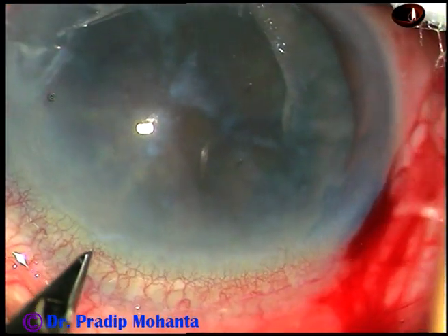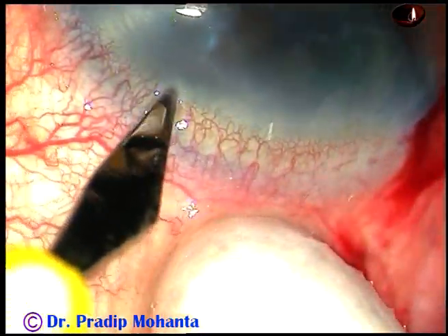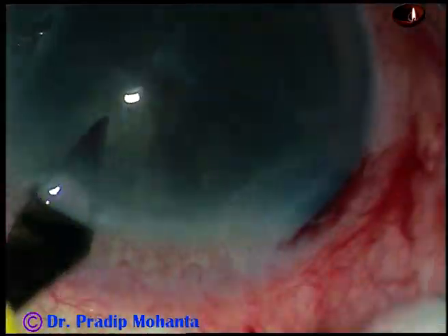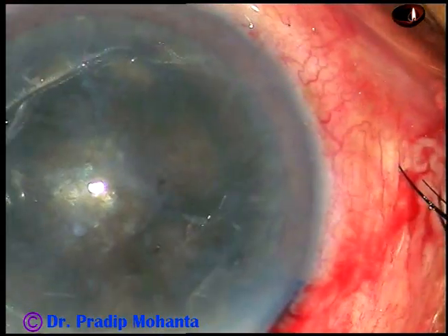Now this is a side port on the left side of the main incision. So we have one main incision and two side ports.